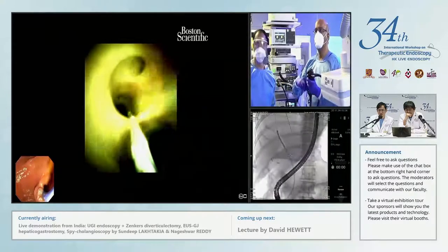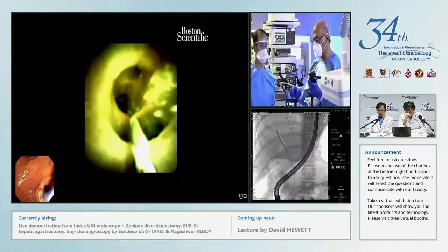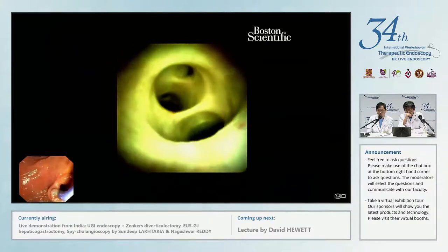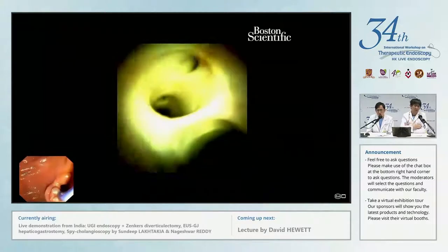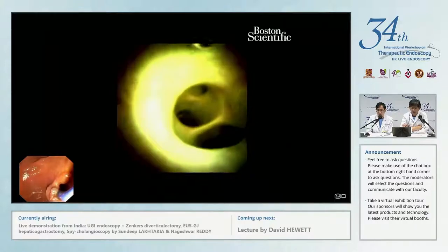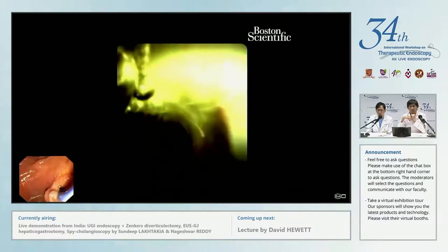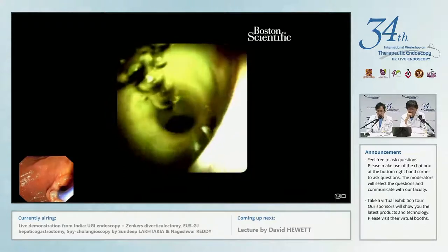Yes. So I'm now going to come down. At this stage, I'll also remove my guide wire because the guide wire is no longer necessary. I'm deep inside. To get a better vision, I'm going to remove my guide wire. And you can see the nice vision here. Yes. So excellent, there's nothing new up there, no pathology as far as I can see. Yes. I come down and again, I adjust. I come down. Now there's something starting to appear there. No, I'm just coming down.